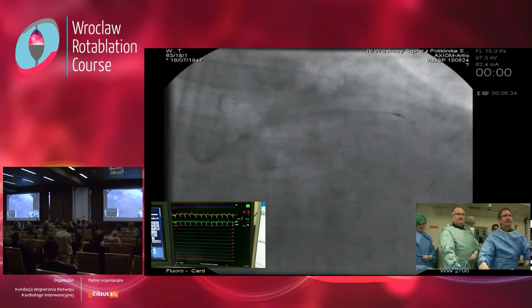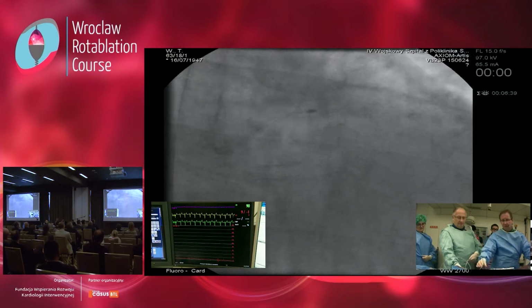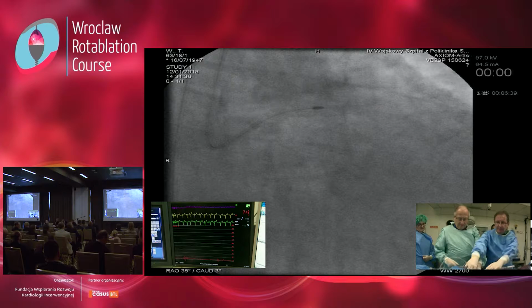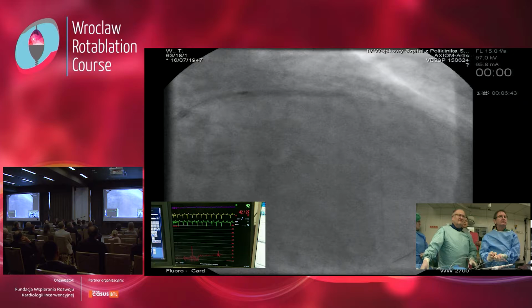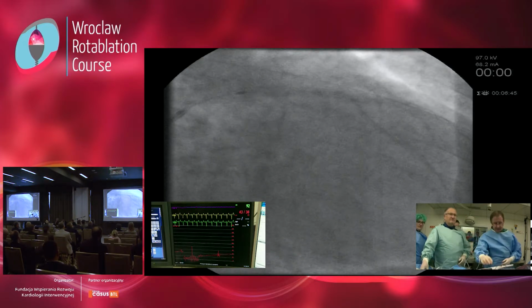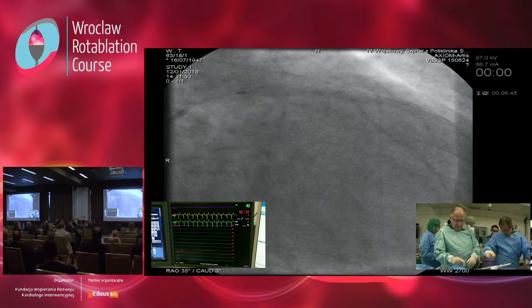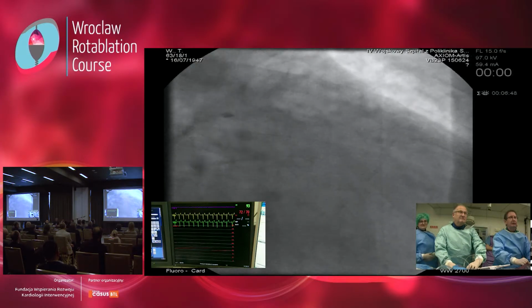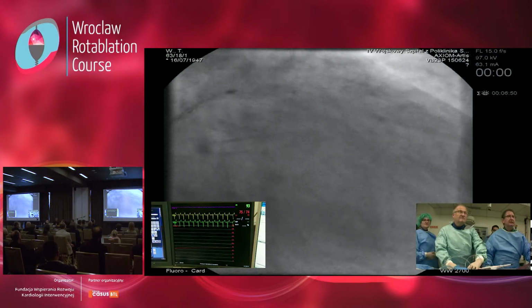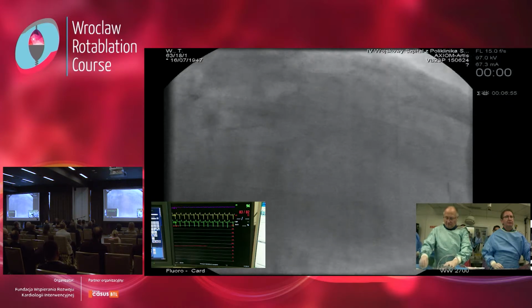So this part is okay. So check the flow. So it's not bad. I think we crossed. So we go now back. So Maciek is going back on Dyna. Are you ready? You tell me. I think it's important to take care where the wire is and guiding. So very good.